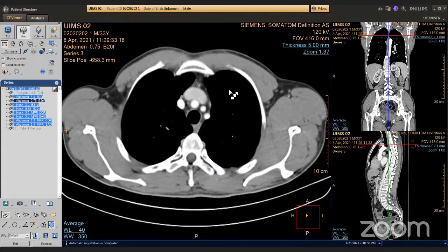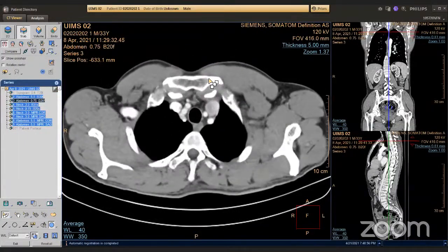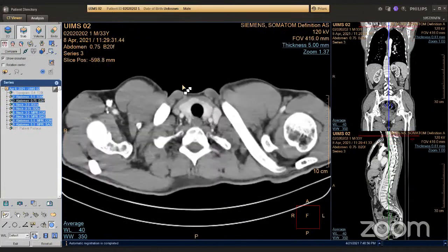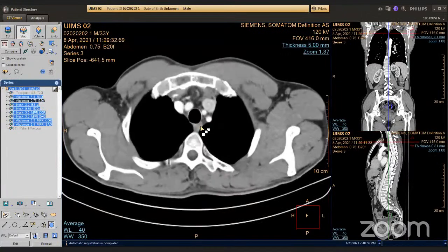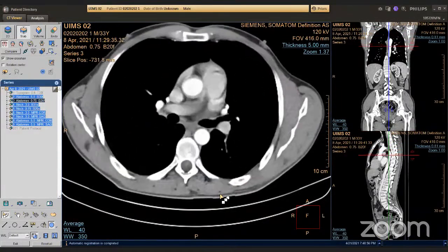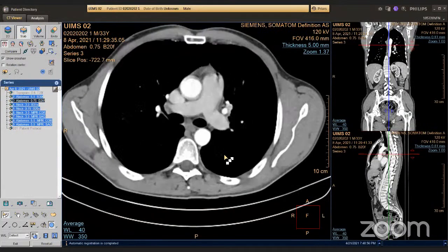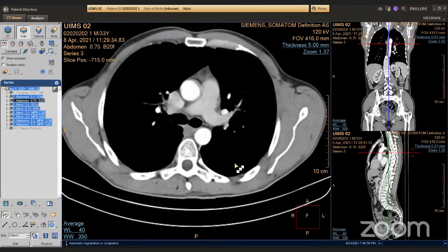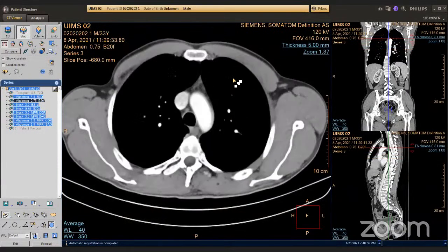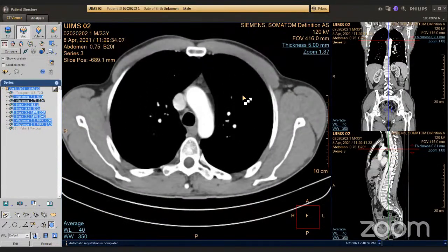You can just go up and you see it's dividing into something that looks like a carotid artery and subclavian artery. Or if you go down, you see that it continues to the aorta. So you know what it is. That's how we work with CT. We are not working with sections. We are working with the whole volume, going up and down every time, and searching.